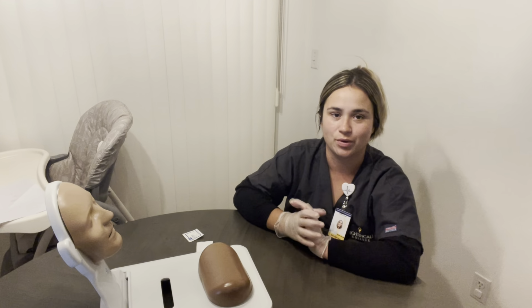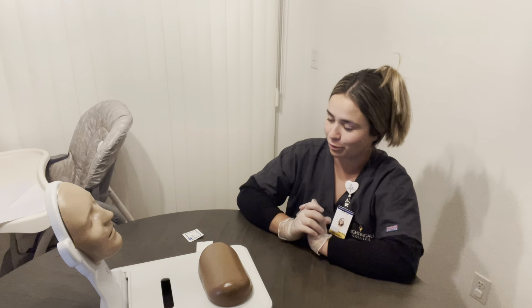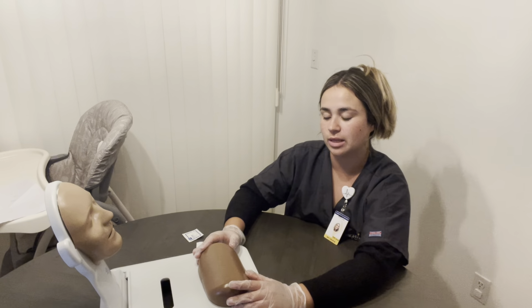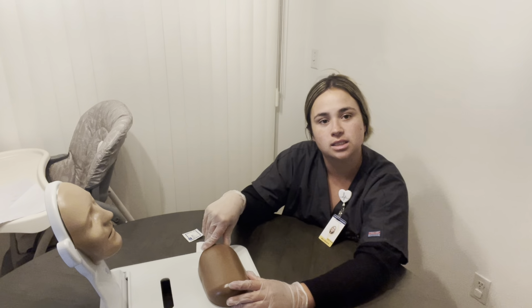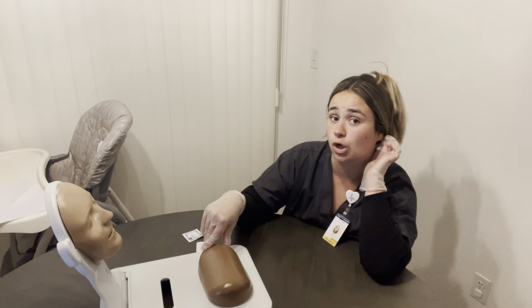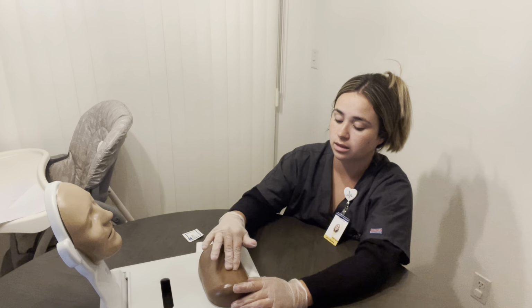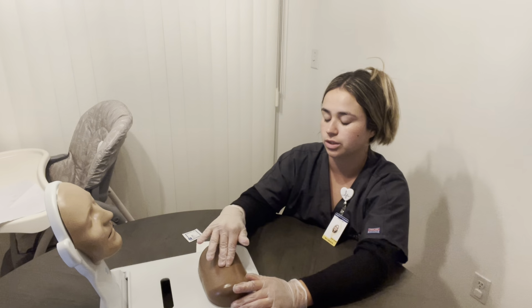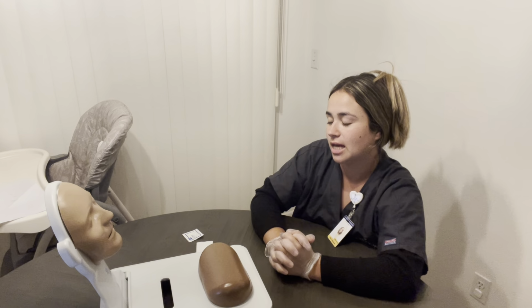find the site that we're going to be injecting, which is the ventrogluteal site. So once we find that location, then we're going to go ahead and inspect. This would be a good time to point out any redness, lesions, bleeding, swelling, anything that we need to be aware of to go ahead and chart. Everything looks good though. Then we're going to go ahead and palpate, just looking for any tenderness. Okay, everything looks good.